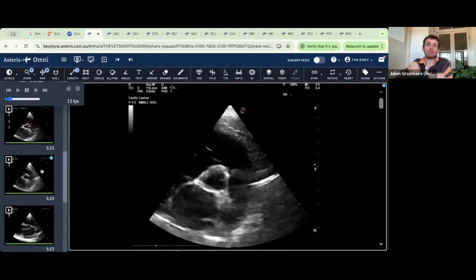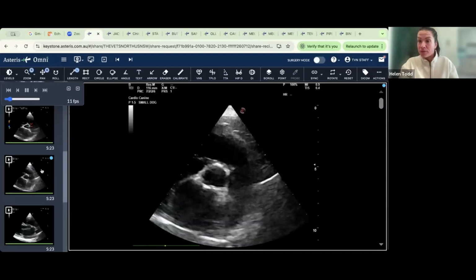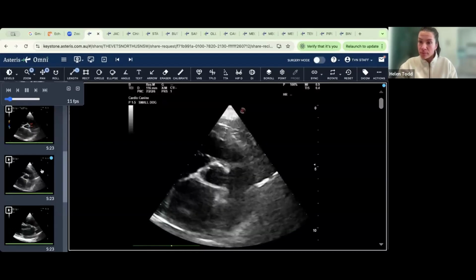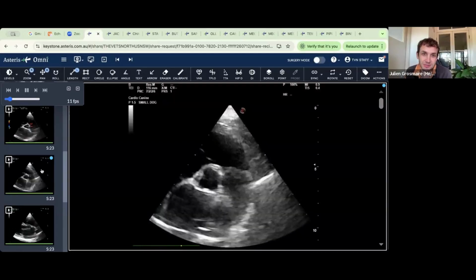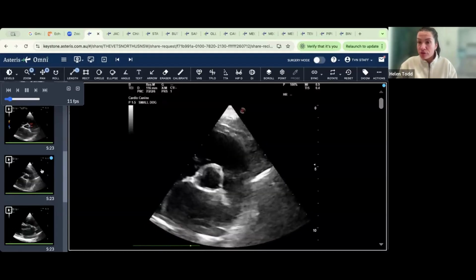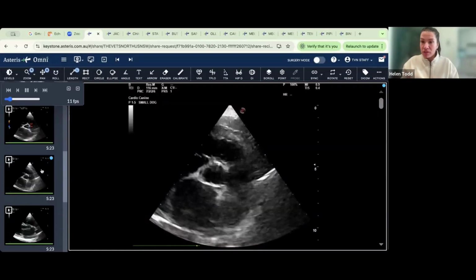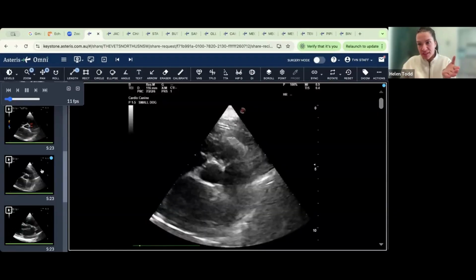Helen, when do you do this view in cats, if you're not doing your LA AO ratio? Same view in all of them. You can absolutely still do an LA to AO ratio. It's quite nice for monitoring and tracking a patient, but you can absolutely make clinical decisions just on your subjective assessment.